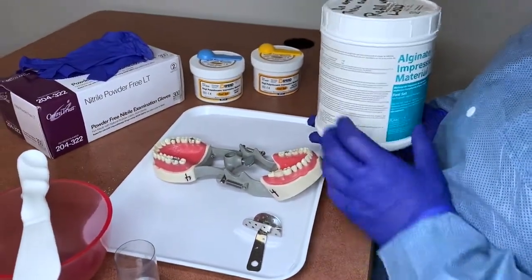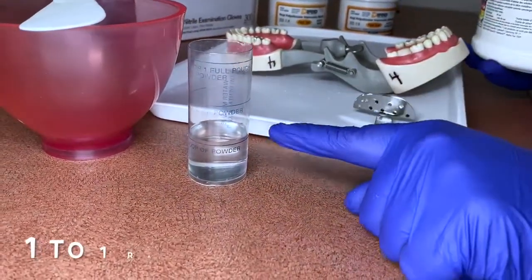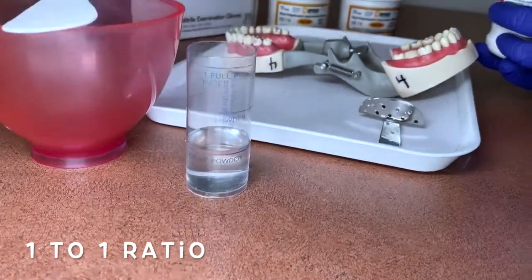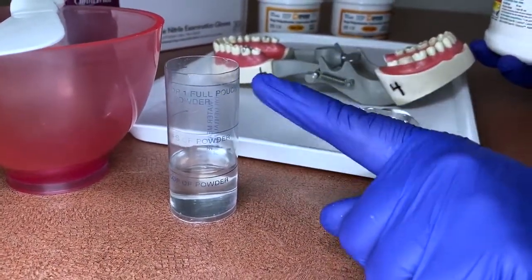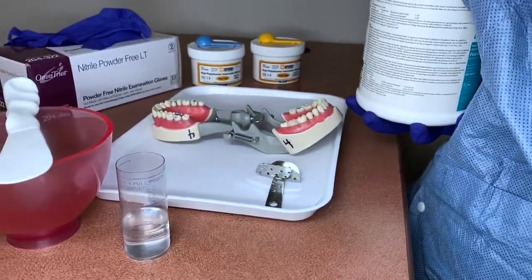Since we're only doing a prep on one tooth, we're only going to use one scoop of alginate. The ratio is one scoop of powder to the first water line. If you were doing two scoops it would go to the second line, three scoops the third line — but for a single unit prep, we only use one scoop.